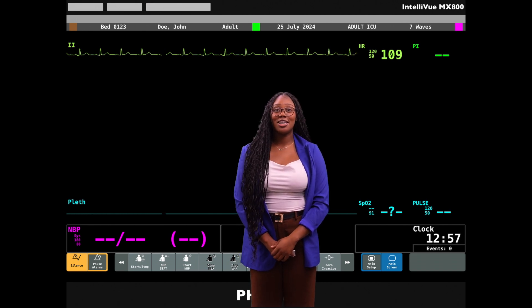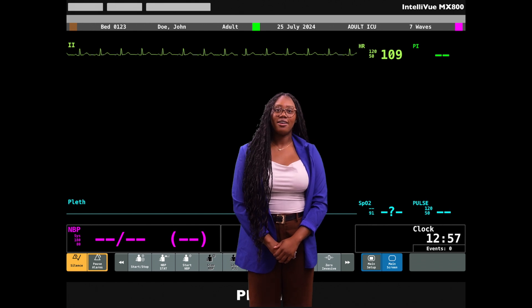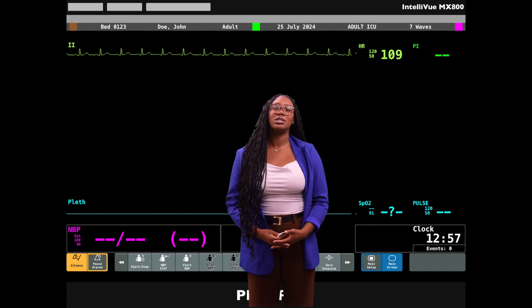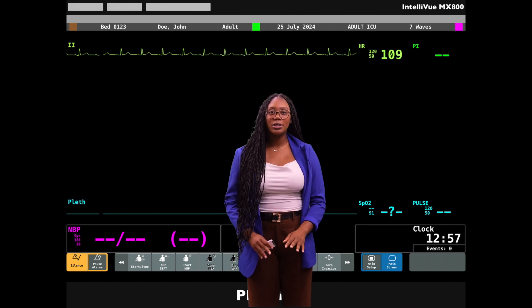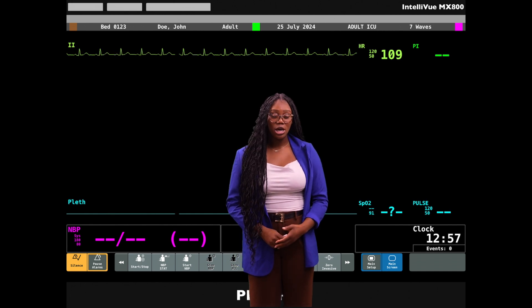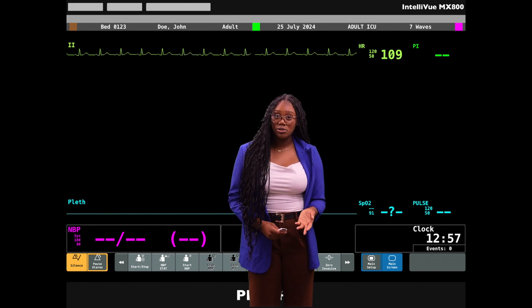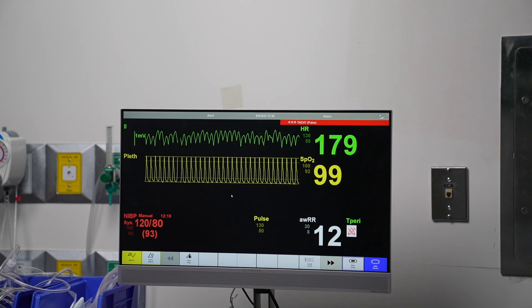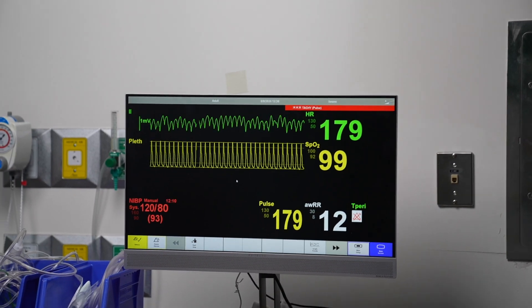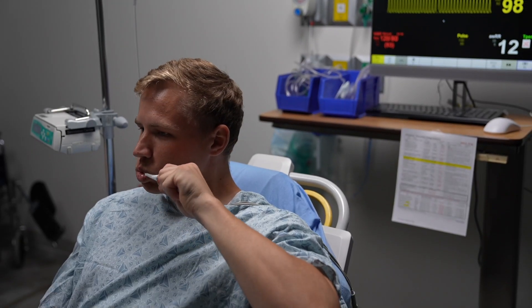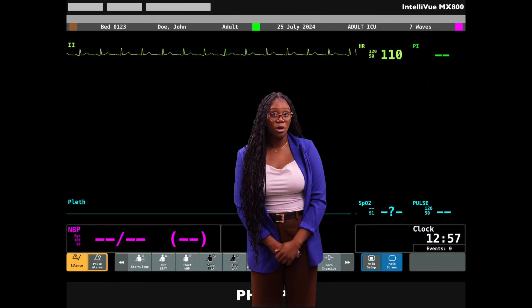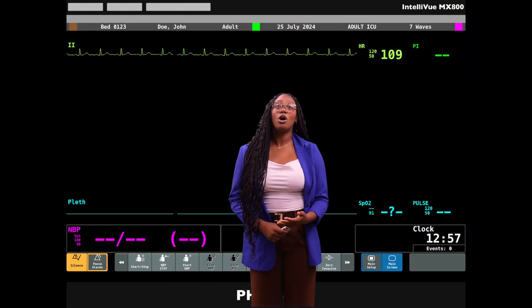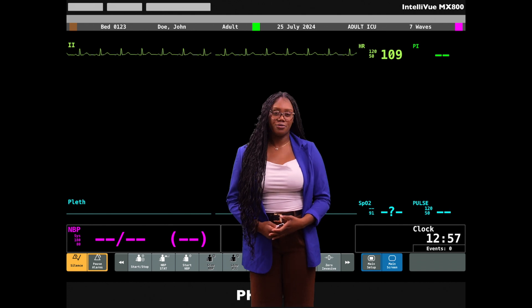It is important to understand that you're only going to get a heart rate reading if the EKG electrodes are on the patient, so make sure your electrodes are properly attached to prevent false readings. Remember, no EKG electrodes, no readings. Also, don't mistake an artifact for tachycardia. A patient who is vigorously brushing their teeth can look like a VTAC on a monitor. Don't trust the monitor blindly — you have to always correlate with your physical exam.